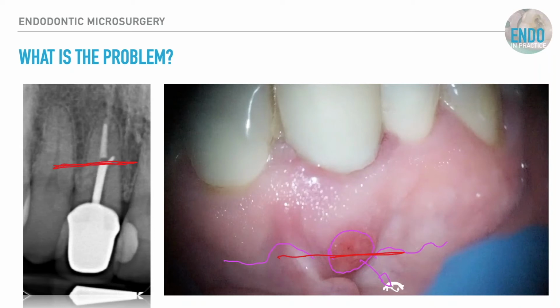Then, when I look at the crown margin, it's not so hot. Certainly on the radiograph, the crown margin doesn't look so hot. And then what you saw was my PCP12 probe slide into about a 9mm pocket all the way to about there. So the reason the PCP12 probe is really important is because it doesn't have that ball on the end of it that your BPE probe does, and that ball really inhibits you finding very localized, isolated periodontal pocketing.